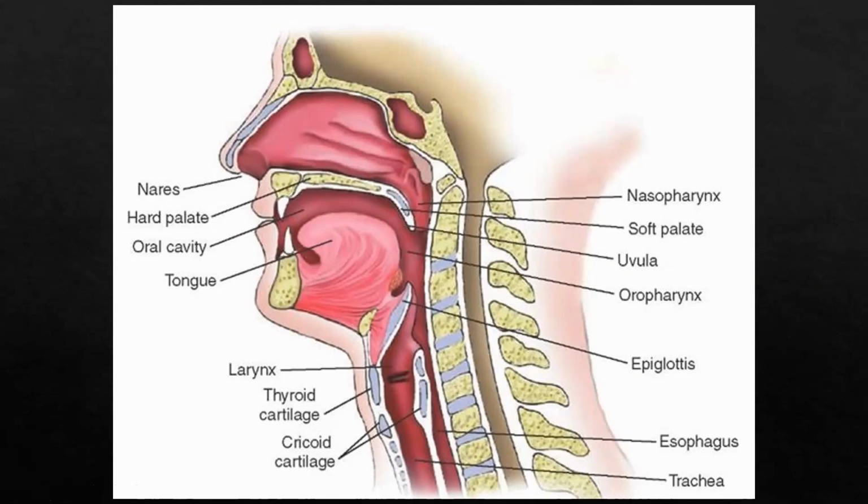And I want to encourage everybody, as you can notice, the hard palate as it extends back turns into the soft palate. Make sure that you are putting a water-soluble lubricant on your tube. That way we can prevent any kind of trauma due to intubation.